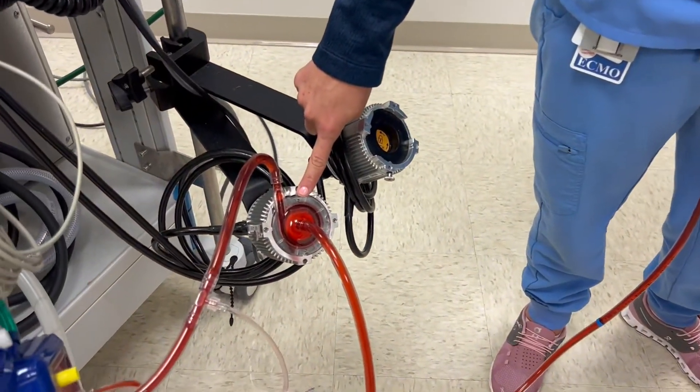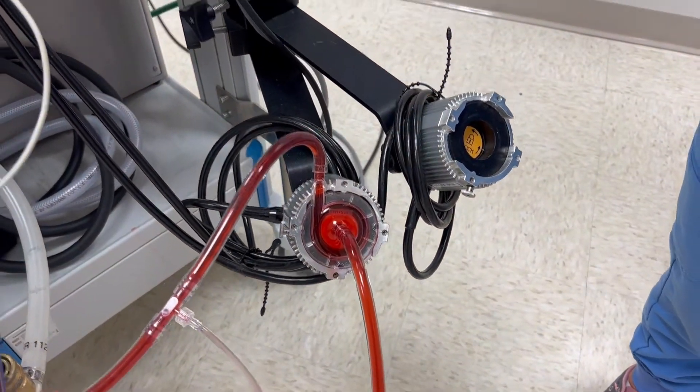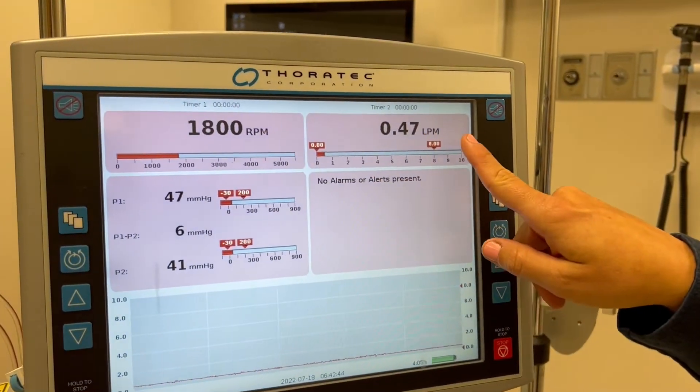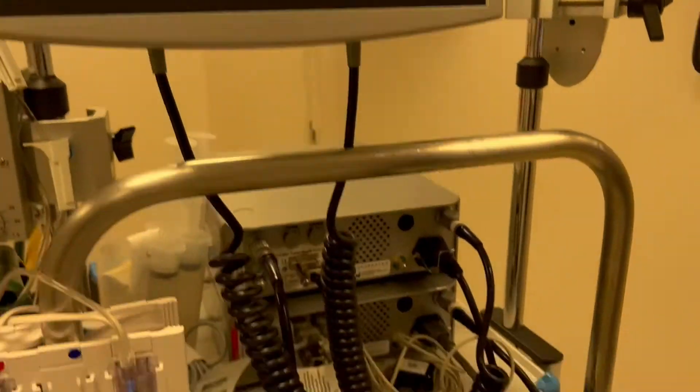This pump head is monitored by the RPMs that we set it at on the given system itself. The RPMs are established and that spits out a flow. Following the pump head, blood is then propelled forward to our oxygenator.